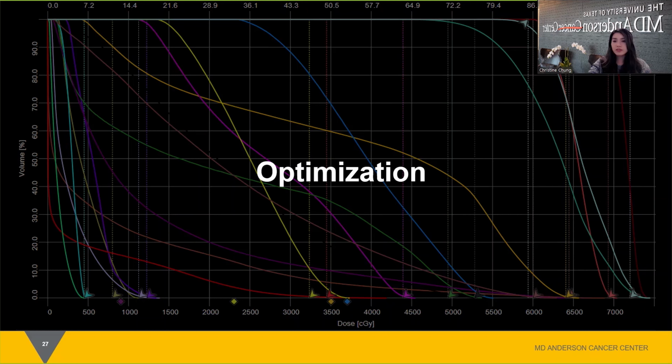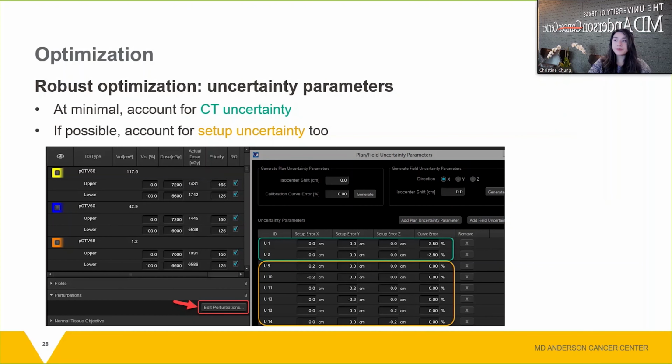checking for beam clearance, choosing treatment machines, snout position and snout size if applicable, adding necessary energy absorbers if the target is too close to the surface, utilizing naming conventions, inputting prescriptions, selecting correct calculation models, and setting up those parameters, such as spot spacing. There's just a lot of things that may be very specific to your institution, so I didn't want to cover those, but we can move on to optimization now.